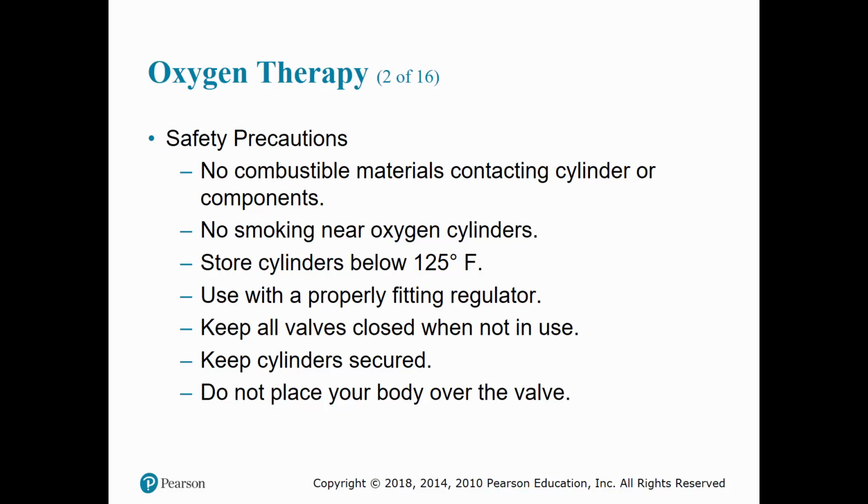Make sure that you store cylinders in an area where the temperature is less than 125 degrees, and make sure that you use an oxygen cylinder with a regulator valve that is properly fitted for that tank. Make sure when the cylinder is not in use, or even when it's empty, that all valves remain closed.